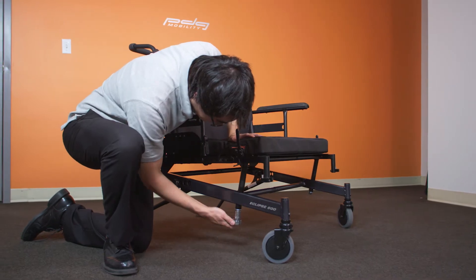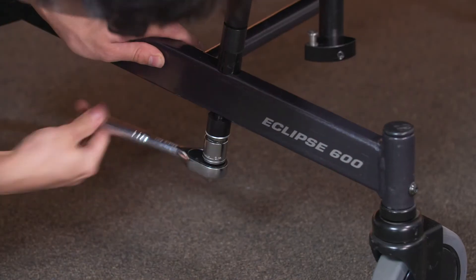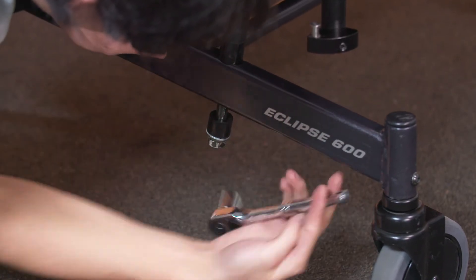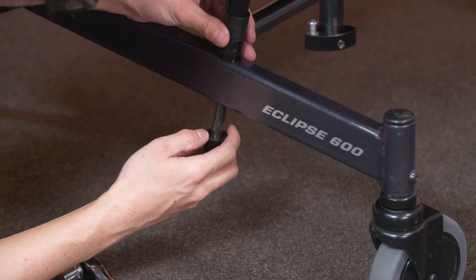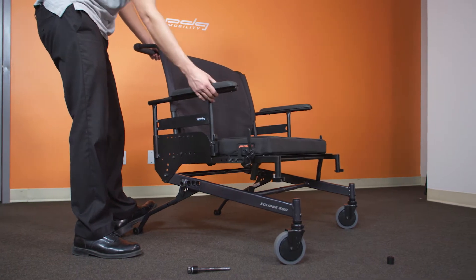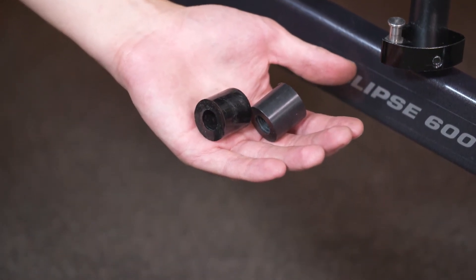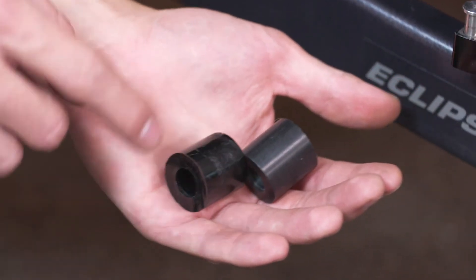A long wrench or socket wrench may be required to produce enough torque. Supporting the upper frame may help with this procedure. At this point you should be able to freely pivot the upper frame relative to the lower frame. Note the difference between the shock absorbers and the spacers. The spacers are hard plastic and matte while the shock absorbers are pliable and glossy.